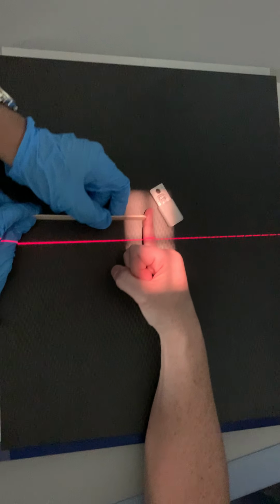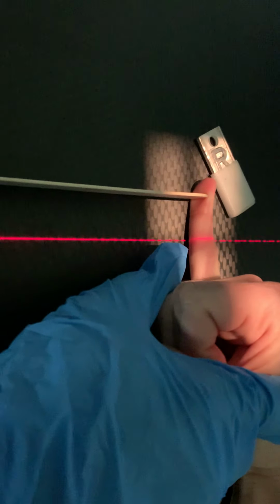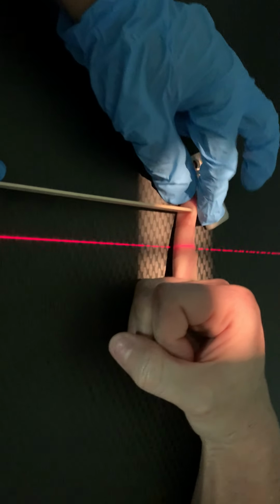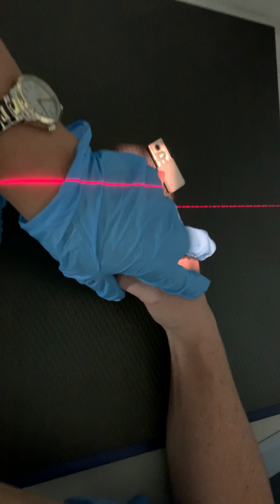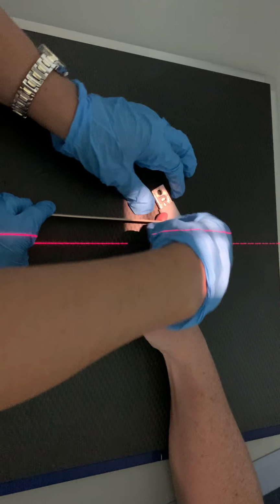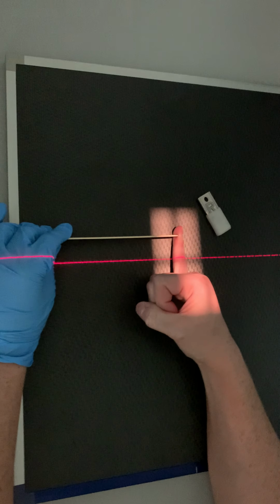I want you to take the end of that tongue depressor and push your finger out and try to relax those fingers down as much as you can. So I'm gonna keep the finger nice and straight. So you're pushing out, but I want you to turn your elbow so that I can keep it. So you've got it like that. Kind of, can you straighten it out? There you go.